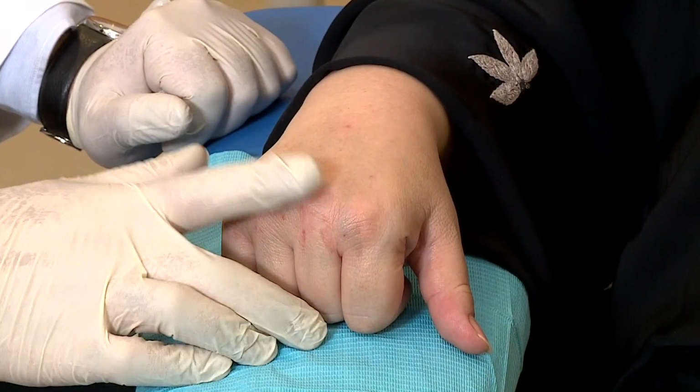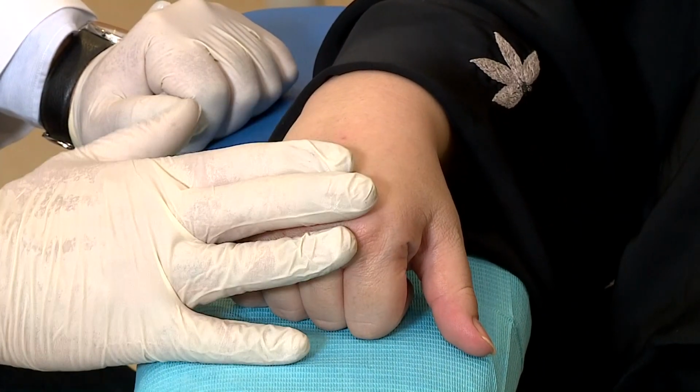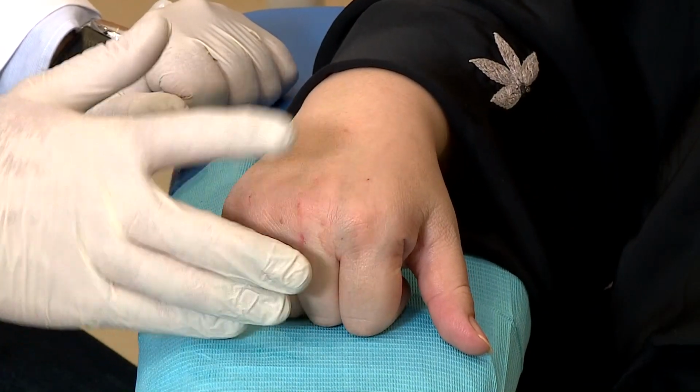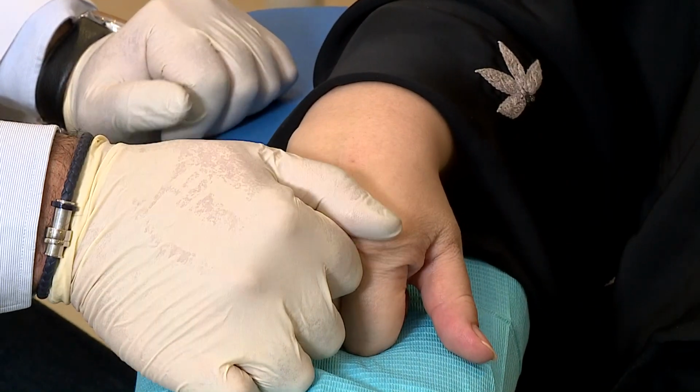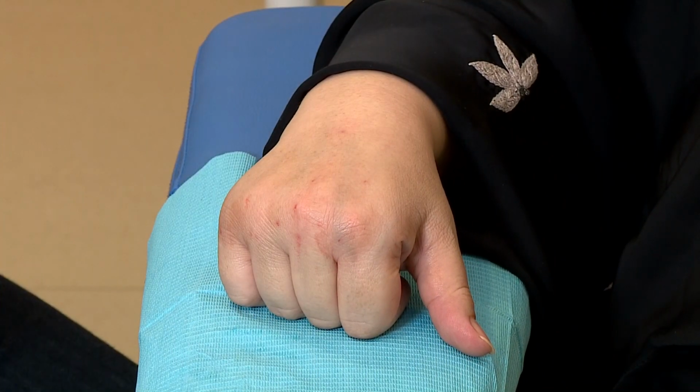And as we can see, with 1 syringe of Radius, we rejuvenated both hands with a very good result. Between the hands, she was telling me, after we did the first hand, how much she appreciated the difference already, which is very good because the patient satisfaction can be very high immediately after the procedure.